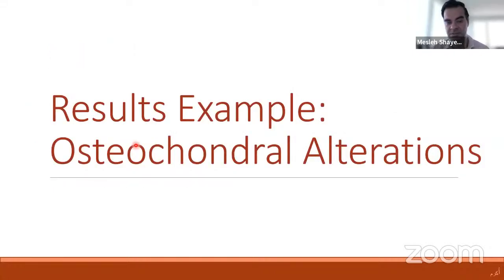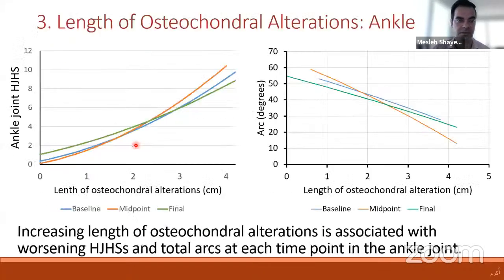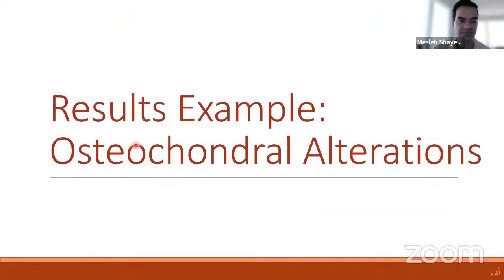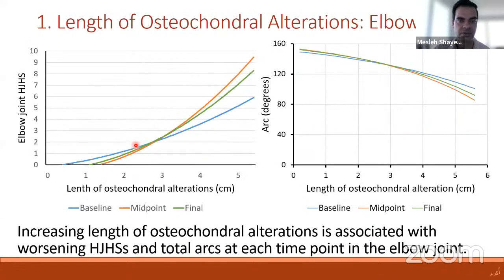As an example, I'm just going to cover the osteochondral traces. So here, in the x-axis is length of osteochondral alteration. And as I previously mentioned, the more the osteochondral alteration, the worse the arthritis. This is the elbow joint.